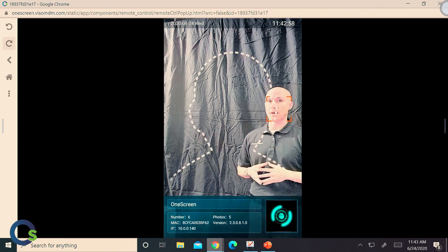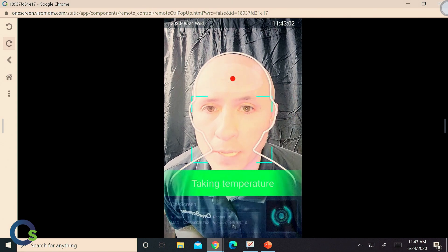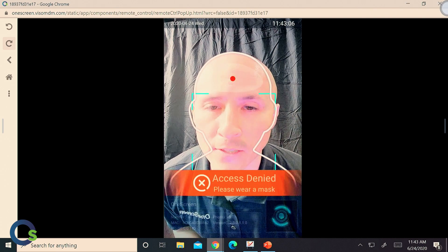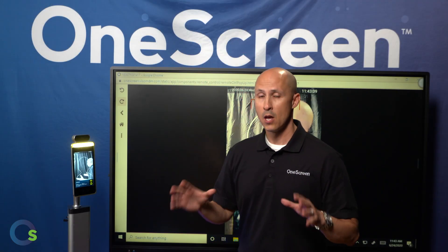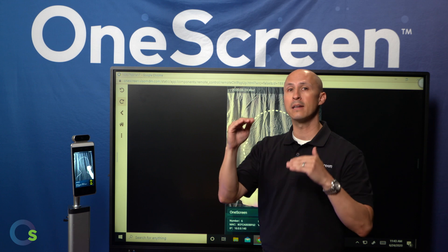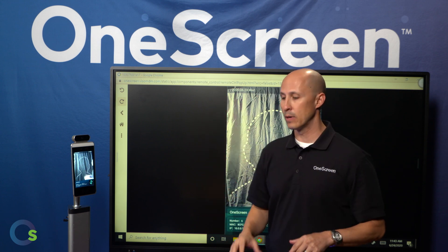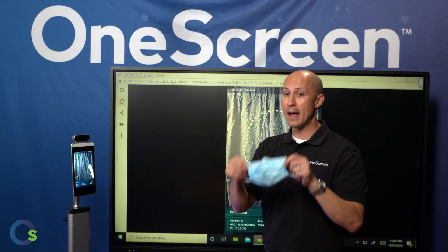As I walk into the device, there's going to be a red dot — you want to place that right in the middle of your forehead. As it takes your temperature, it's going to deny me access. Why? Because I was not wearing a mask — we happen to have that setting clicked on. Remember, there are a lot of different parameters on our device, and it's your choice on how you want to set this up. In our case, we have temperature but we also have mask recognition.